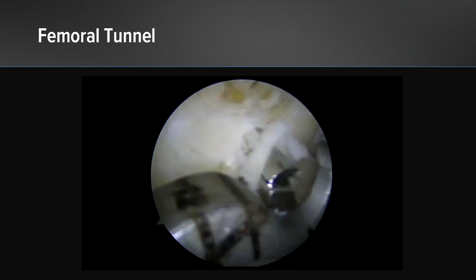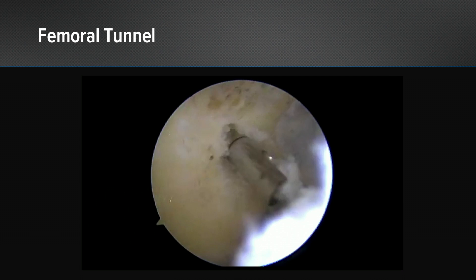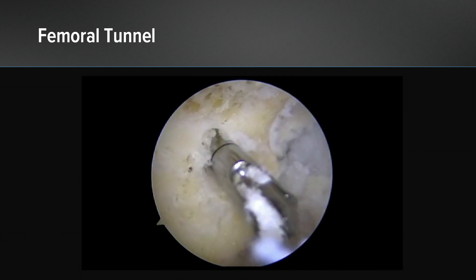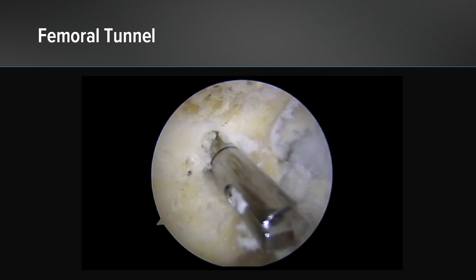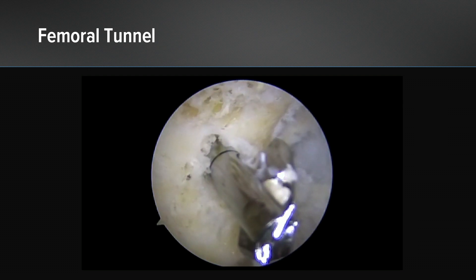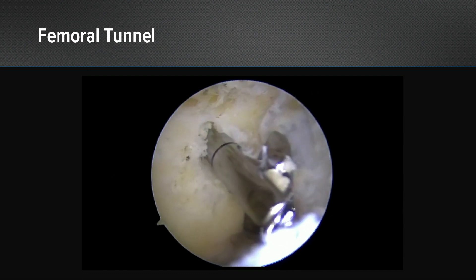The more rigid Flip Cutter 3 makes it easy to just raise your hand a little bit and then come into the spot you want to establish your femoral tunnel. This was a 10 millimeter femoral tunnel, and as we deploy it you can hear the clicks — you can deploy it to the size you want, anywhere from 6 millimeters to 12 by half sizes at every step.